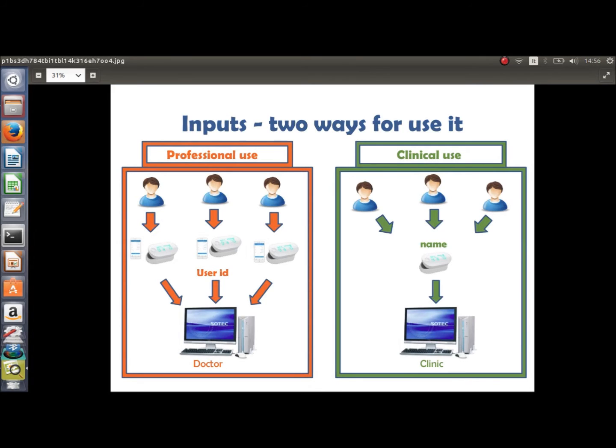The program can be used in two ways. The first one, which can be run by clicking on Listen Measurements Incoming on the web service, is used when patients own iHealth sensors or the iHealth app. Patients send measurements to their doctor with their iHealth sensor or using manual input mode. The program receives them and checks the user ID that is associated with each iHealth app, so with each patient. This way, it is aware of patient identity for doing all the work.